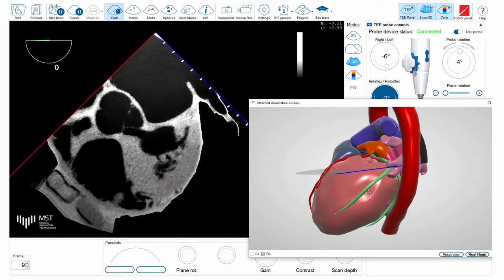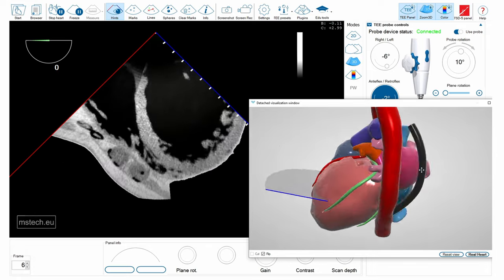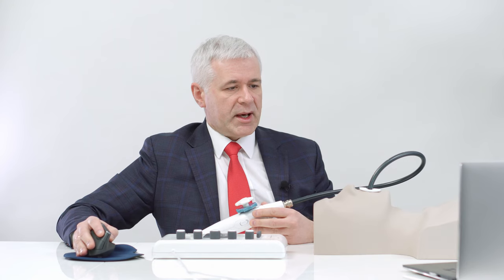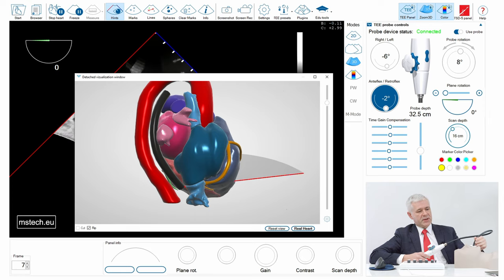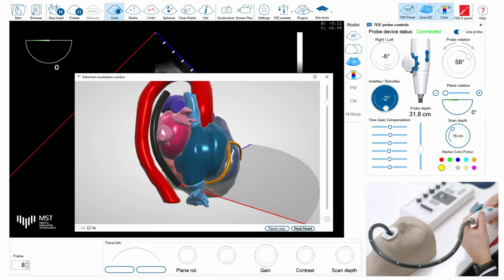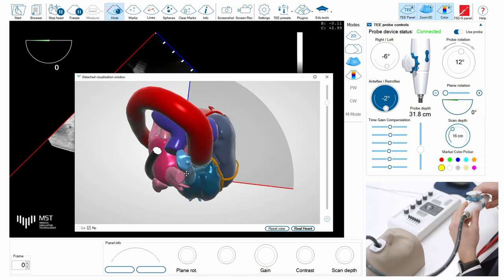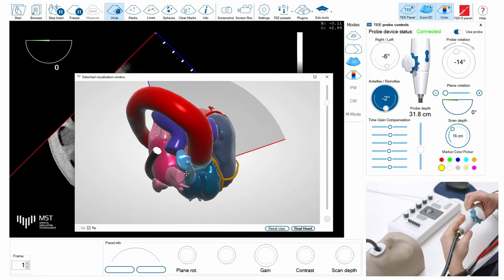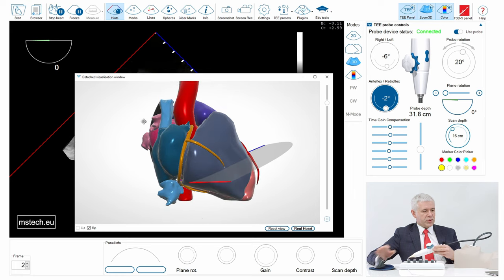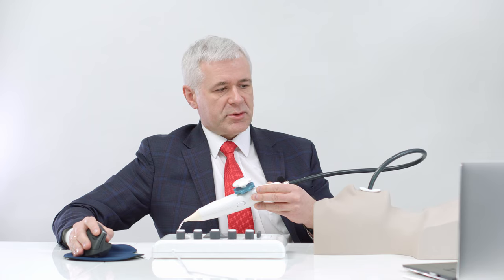Here we can see when I insert the probe into the esophagus it goes down, and I can rotate the model to see where the probe is at a given moment. I can also observe all the manipulations — probe insertion in centimeters, rotation of the probe in degrees — so here you can see how I rotate clockwise or counterclockwise. I can also flex the probe anteriorly or posteriorly as well as right or left.